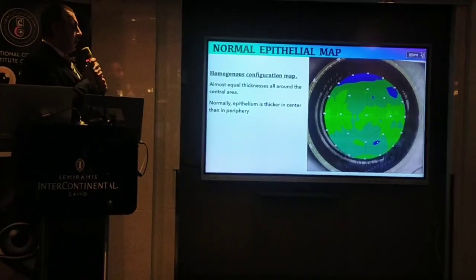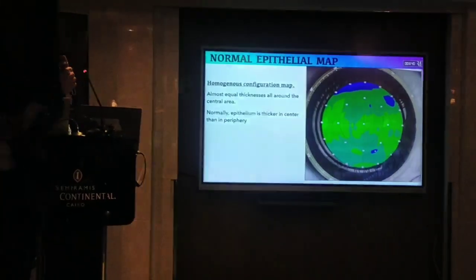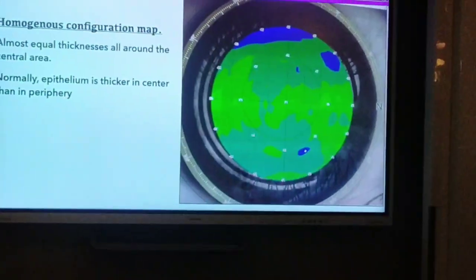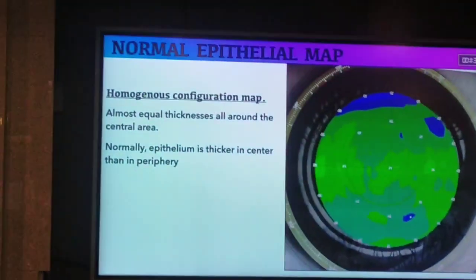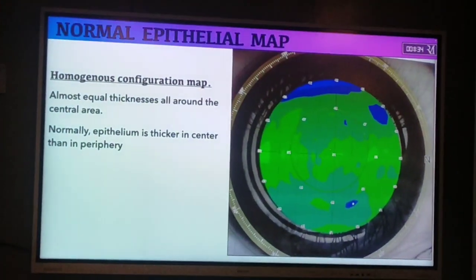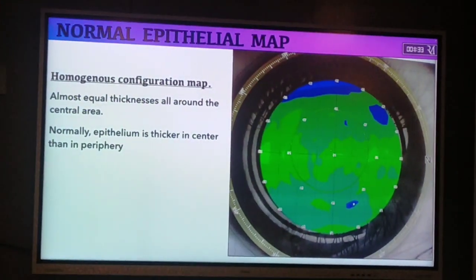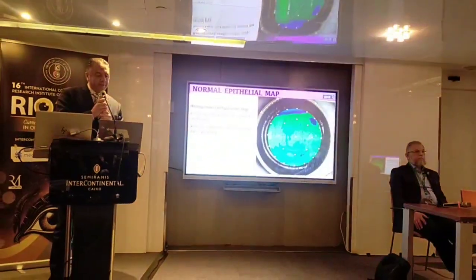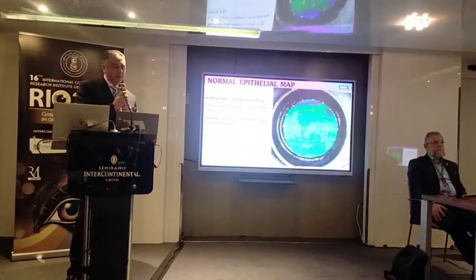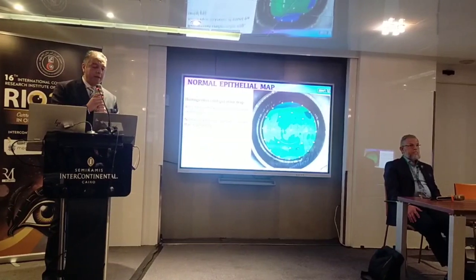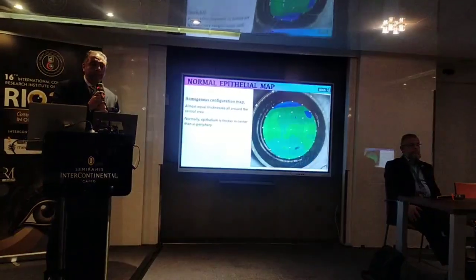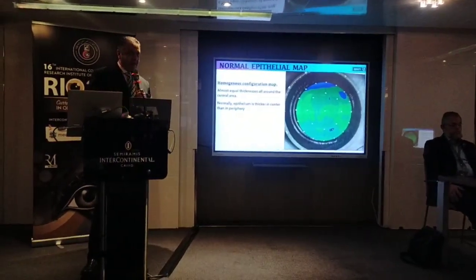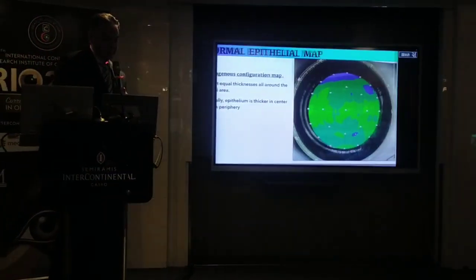This is an example of a normal epithelial map, where the epithelial thickness is homogenous all around, especially in the central part of the cornea — almost equal thicknesses all around the central area. Normally, the epithelium is thicker in the centre than in the periphery, which is the opposite of corneal thickness.